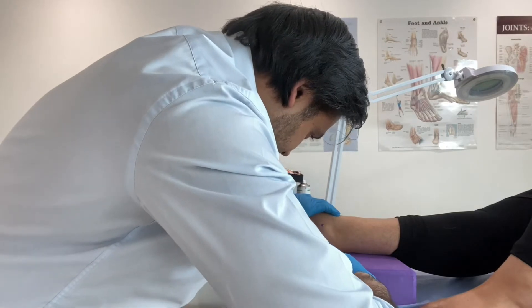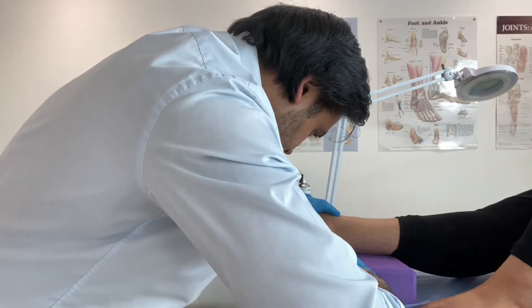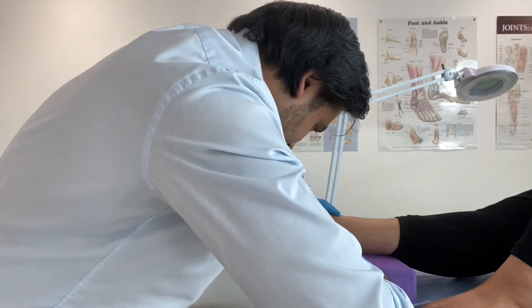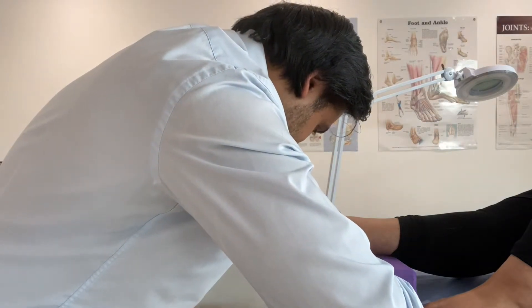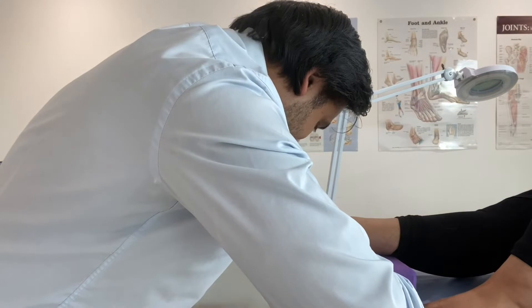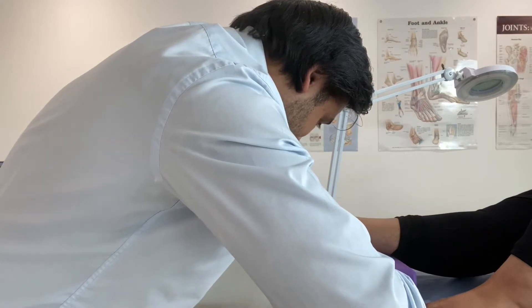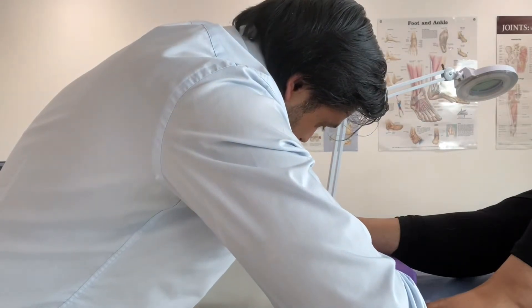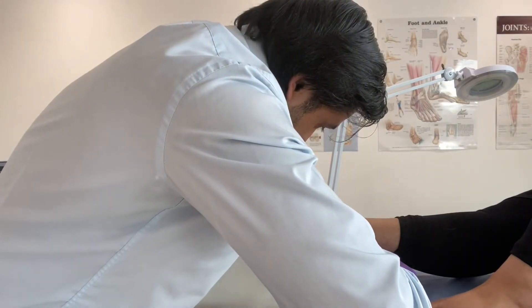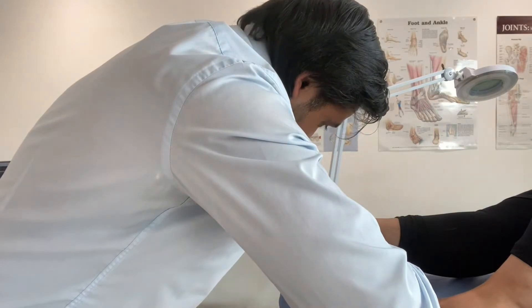You'll feel a little scratch — one, two — there you go. Well done. Now, you might feel some tingling in your toes. I could sing the song to you right now — like, I can feel it in my toes, love is all around me — my singing voice isn't that great.